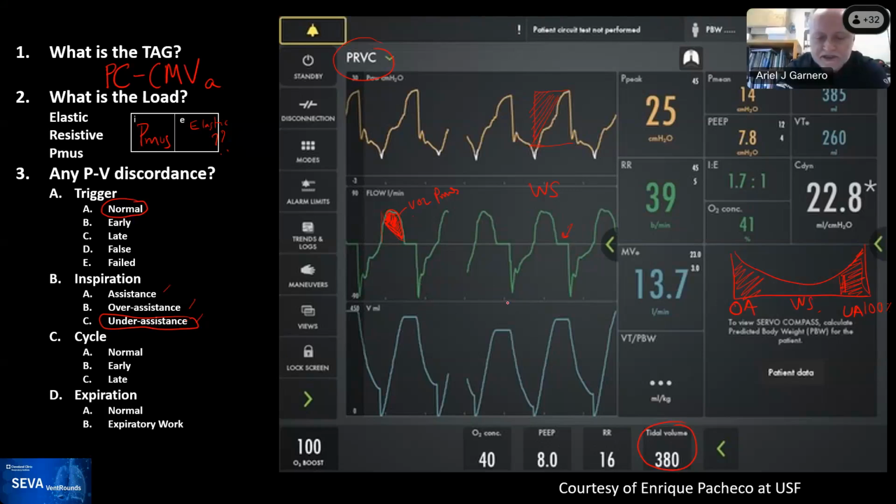Okay, when trying to say that we got a PIP of 25, the inspiratory flow reaches 0 before the PIP. So I consider the pressure to see the work shifting. If we draw a line from the inspiratory flow reaching 0 until we get to the pressure waveform, it should be around 16, I guess. When I'm trying to say that this is the work shifting, the rest seems to be the opposition, I mean, the patient trying to exhale.